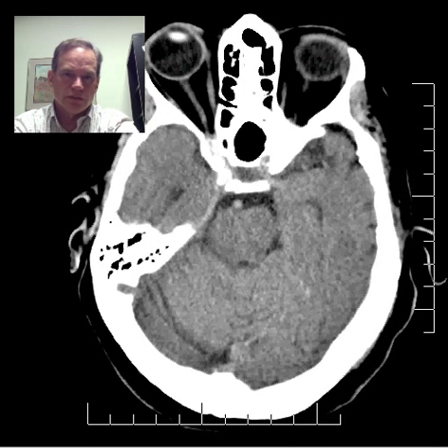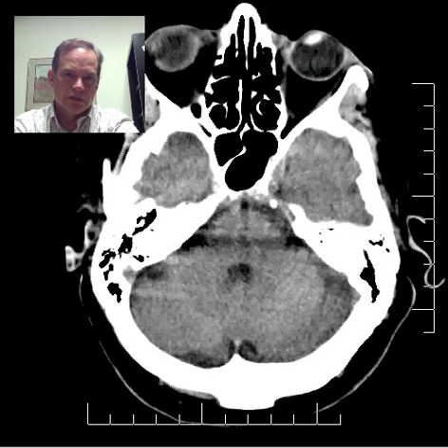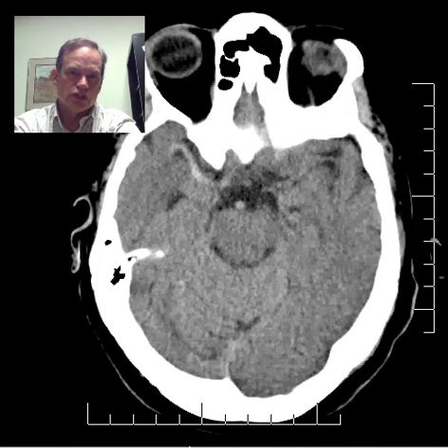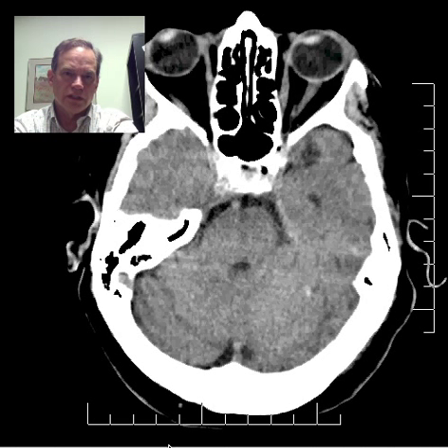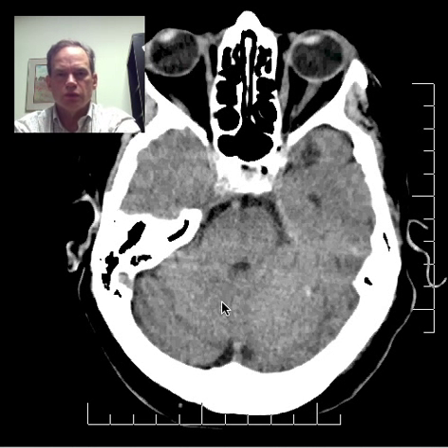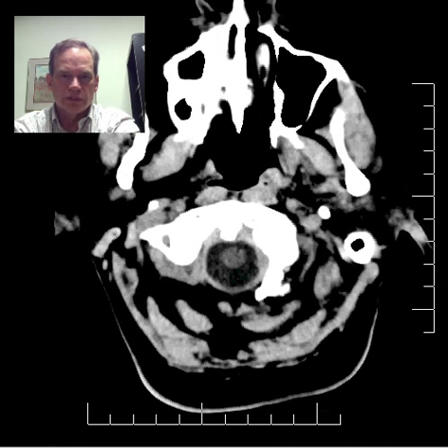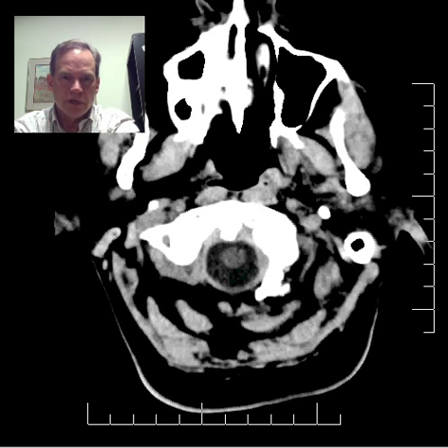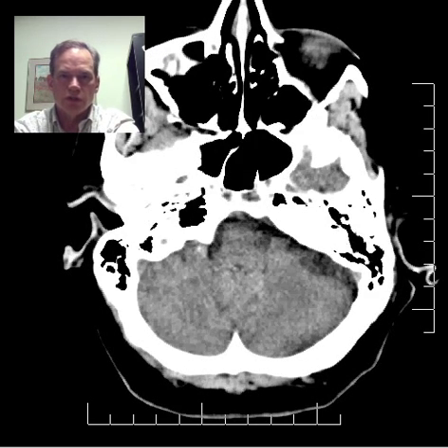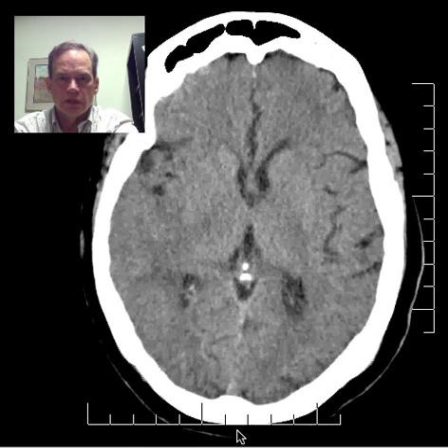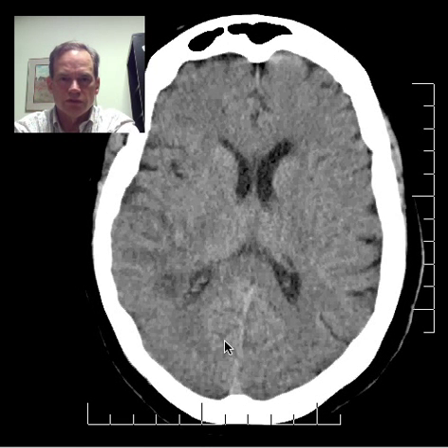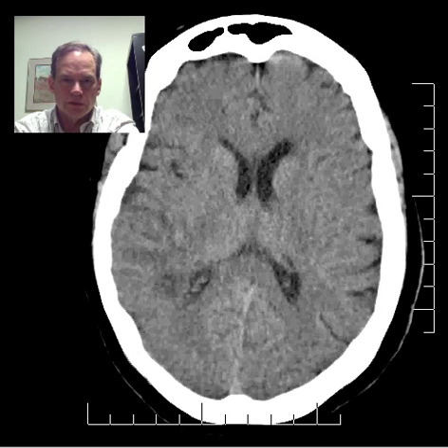The basilar artery is more difficult to evaluate because it's smaller, and there's more high attenuation related just to the vessel wall. However, this actually looks a little suspicious to me for possibly having a clot in it, which could be the cause of the posterior cerebral artery issue — if indeed this is a real finding, and I think there is something going on there.